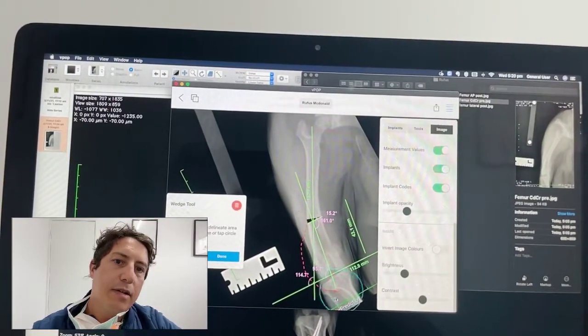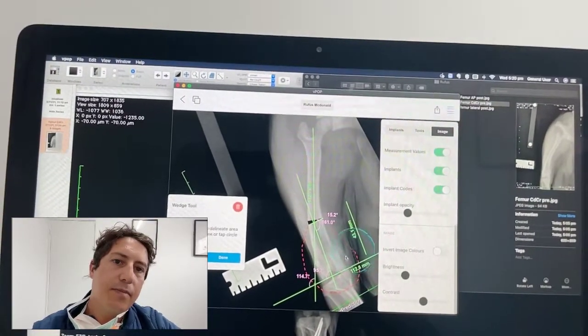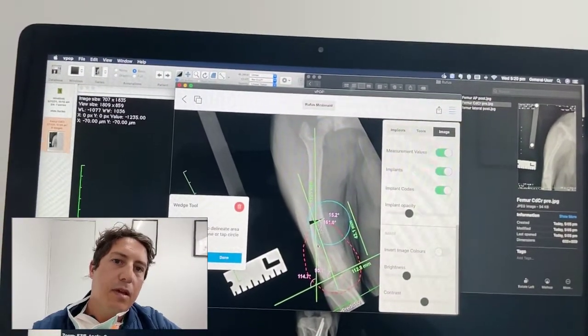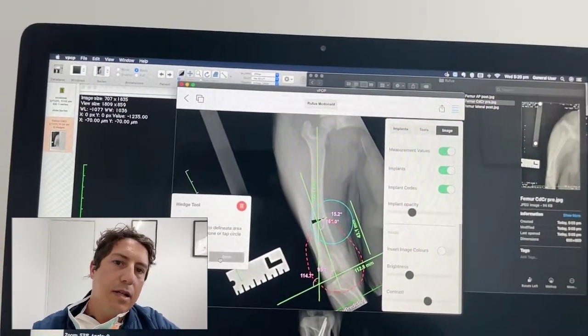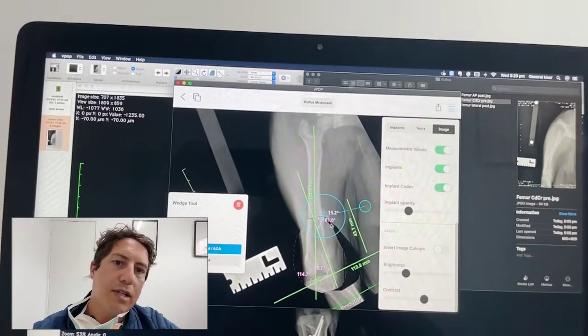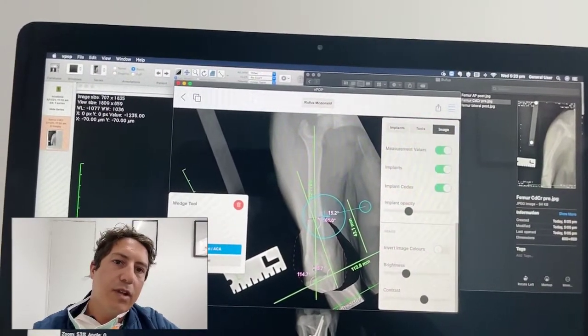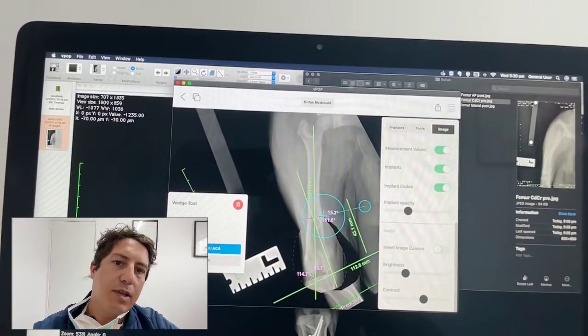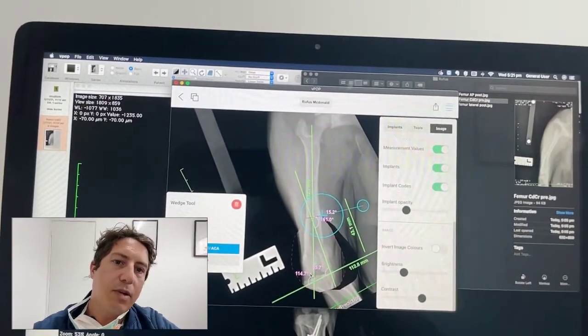I can actually go ahead and cut out the bottom of the bone like this, hit done, and that takes out the wedge — and you can effectively see what kind of straightening we get.